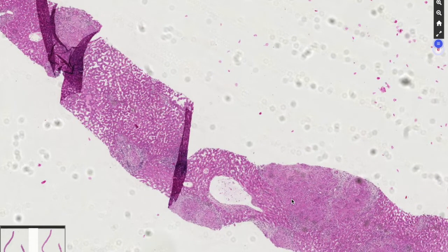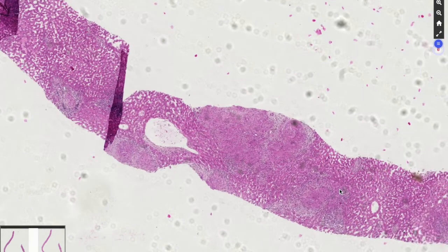So the prognosis, due to the destruction of the bile ducts, may be adverse, and some patients may undergo liver transplantation, and we had a few cases. So really a typical textbook slide of liver sarcoidosis.